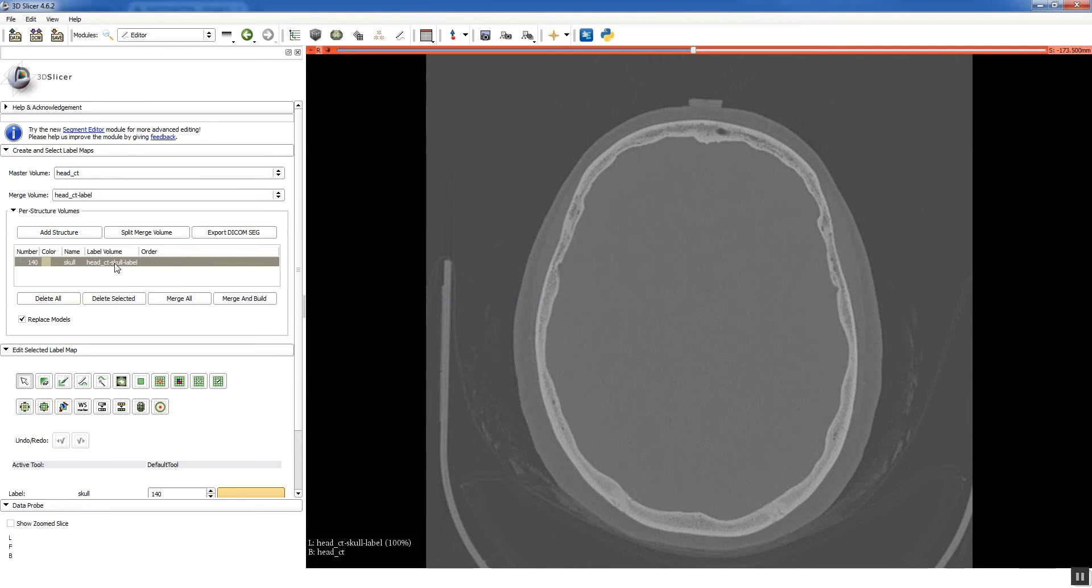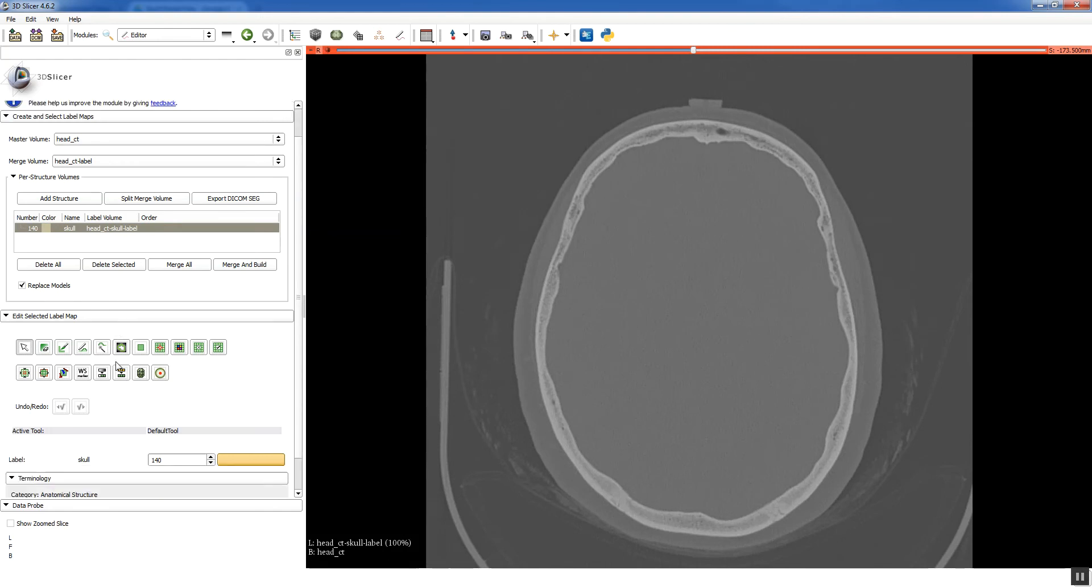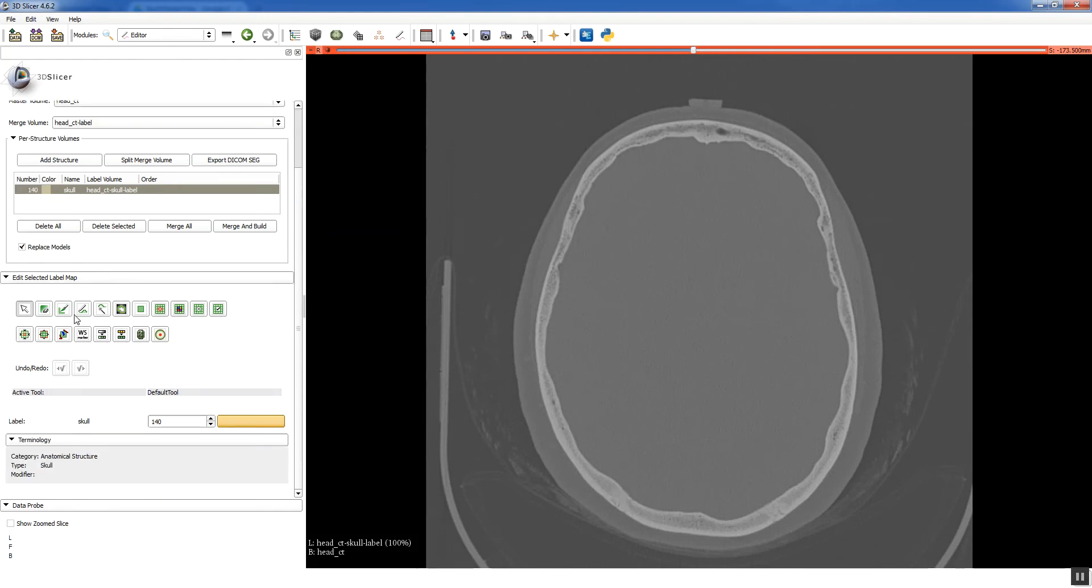So as you're coloring or segmenting, each structure that you're interested in, the color for that is called a label in Slicer. Down here you have a bunch of buttons and that represents all the different functions you can do to segment your volume. And we'll go through quite a few of those just trying to get the skull segmented.